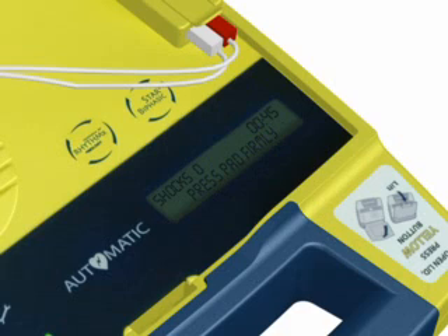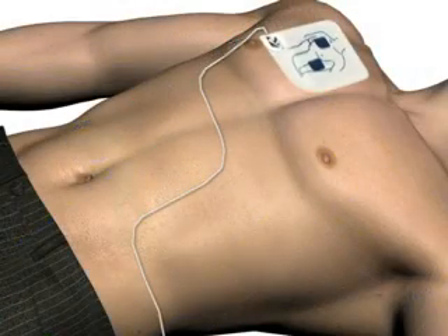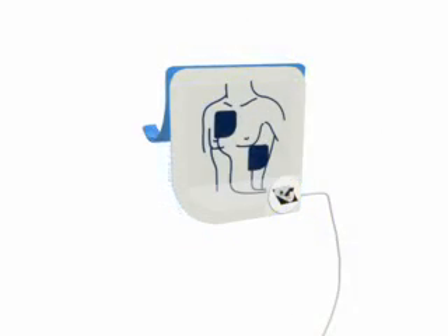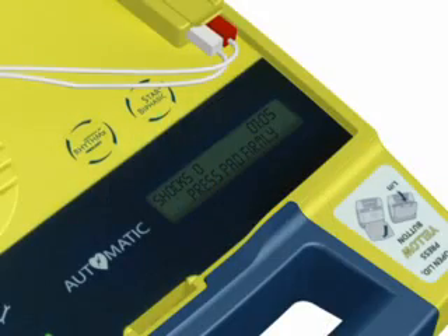Firmly place the pad without the liner on the patient exactly as illustrated. This pad can be placed on either of the two locations shown. Peel the blue plastic liner off of the second white pad. Firmly place the second pad on the opposite location, exactly as illustrated.